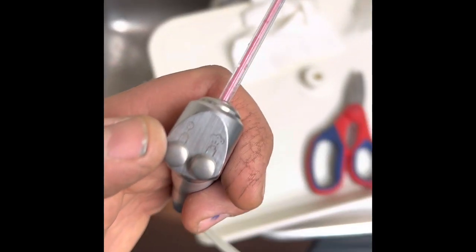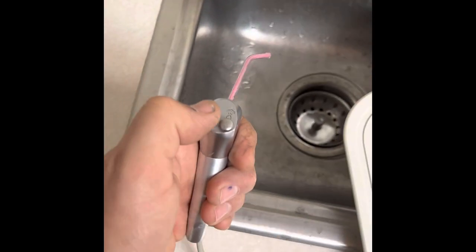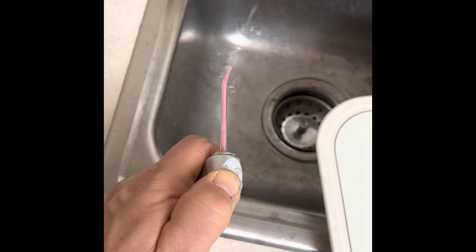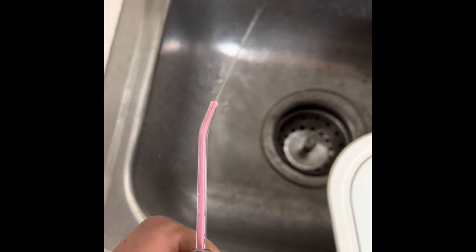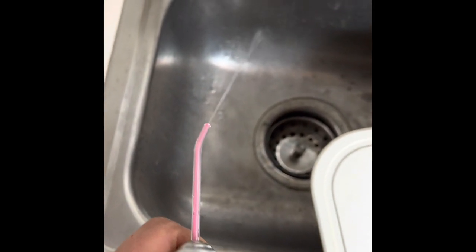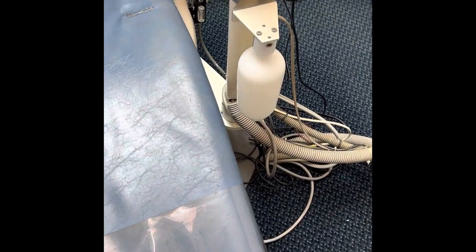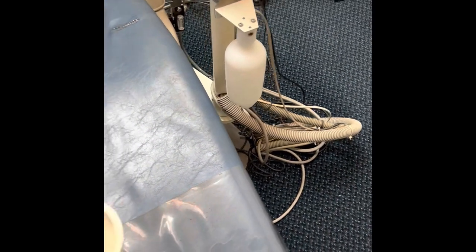Hey guys, I just had this really interesting problem where there's air coming out of the water on this air water syringe. See how it's kind of spurting? Okay. Now what's interesting is I already changed the bottle manifold and it didn't fix the problem, because that's the main point where the air and the water can mix.